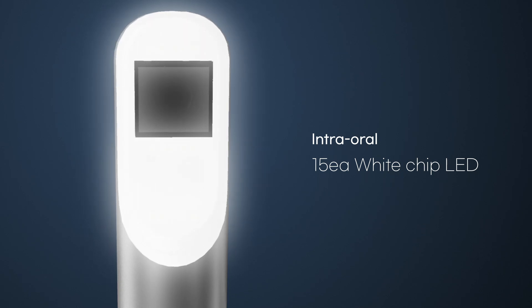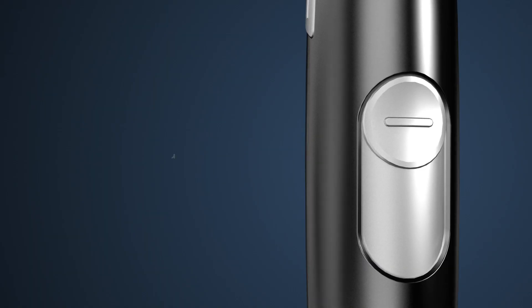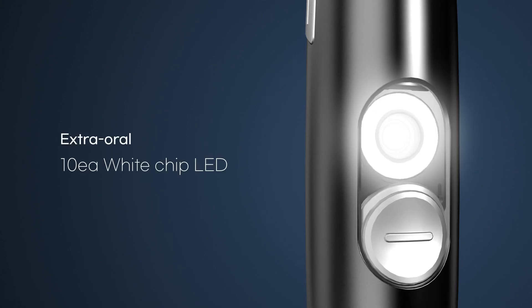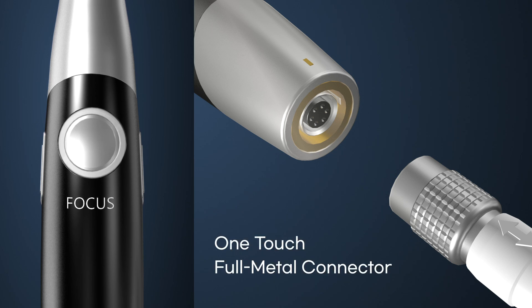It automatically switches from intraoral camera to extraoral camera by detecting whether the slide cover is open or closed. The slide cover is designed to protect the lens of the extra camera when not in use. It is also easy to connect and disconnect.